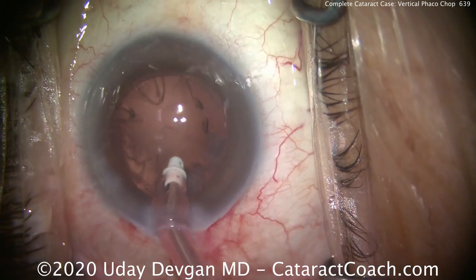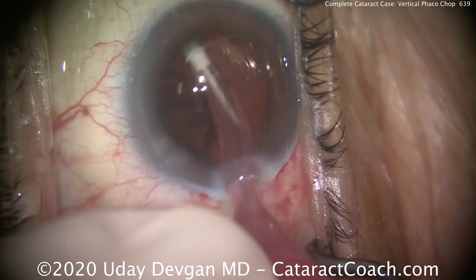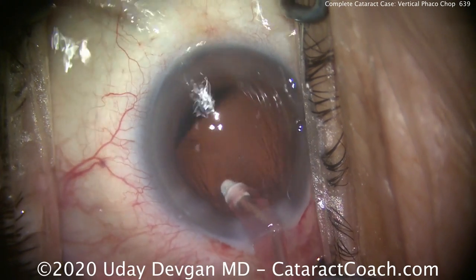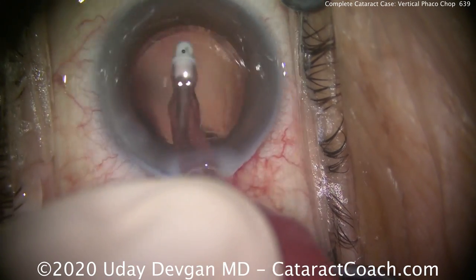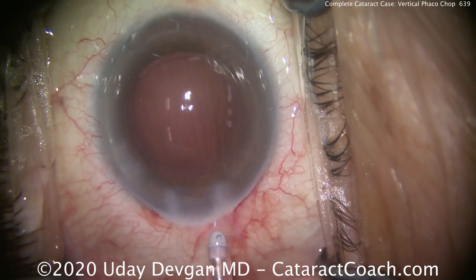You can see in about three minutes from the start of the case, the whole nucleus is already out of the eye — so it becomes a very efficient procedure. Lens cortex removal using a circumferential manner to get that cleaned up quite nicely. I'm using a very experienced surgical tech, and that tech is loading up the lens for me — she does a fantastic job, so I don't have to load the lenses. Clean up here, looking really good. A little bit of capsule polishing on the undersurface of the capsule rim as well — really get this looking pretty.